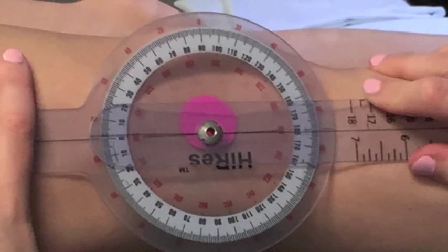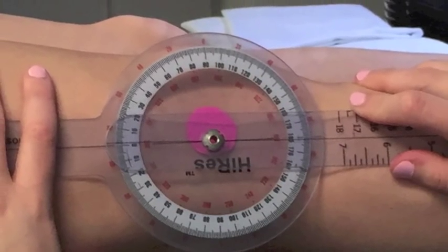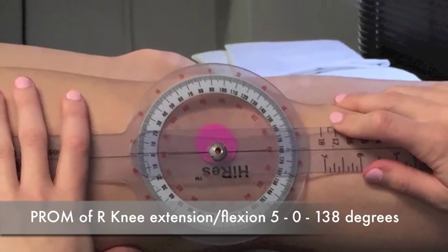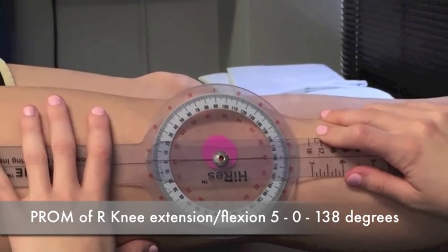If the patient presents with a hyperextension of 5 degrees and a total knee flexion of 138 degrees, the appropriate way to document that would be: passive range of motion, right knee extension-flexion, 5-0-138 degrees.